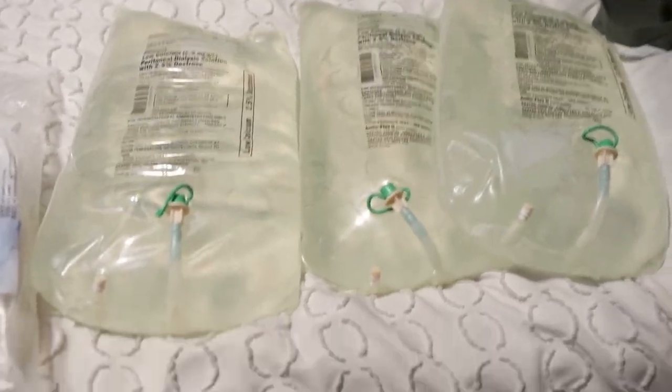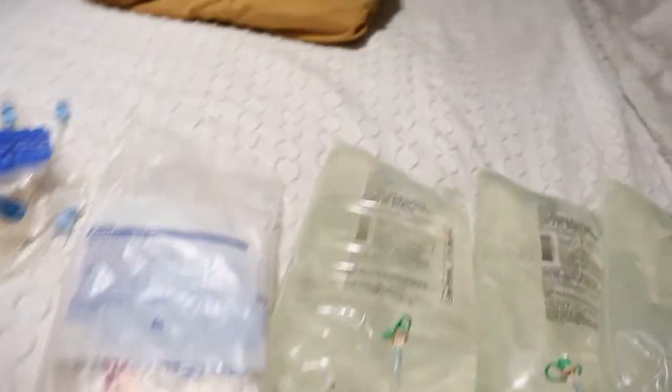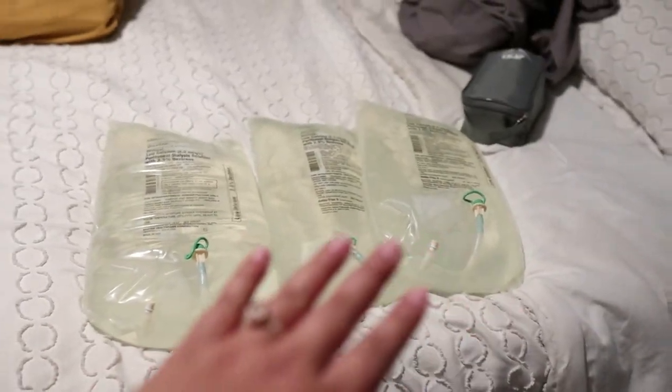He uses 18 liters of fluid every night. So whenever we have to travel, all this stuff has to come with us. This is everything he uses in one night — so imagine if you have to travel, you have to take multiples of all of this.